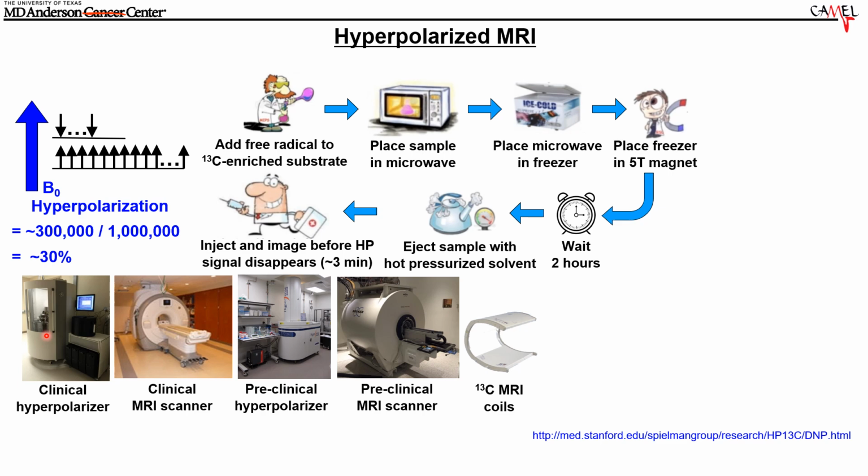Here's a clinical hyperpolarizer, kind of looks like a vending machine where the material comes out ready to go. It's all been validated to be safe for patients, and then you can inject that into a patient who is residing in a clinical MRI scanner.